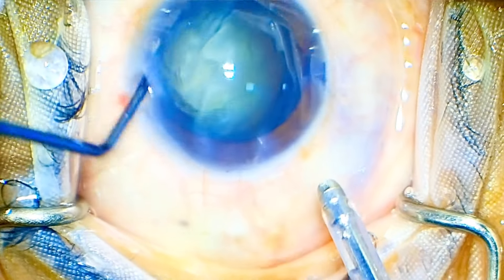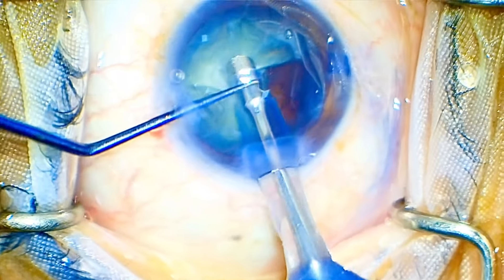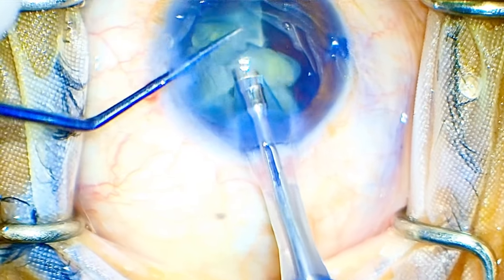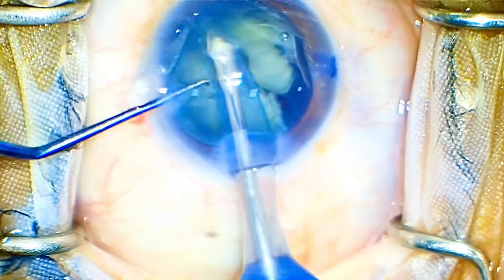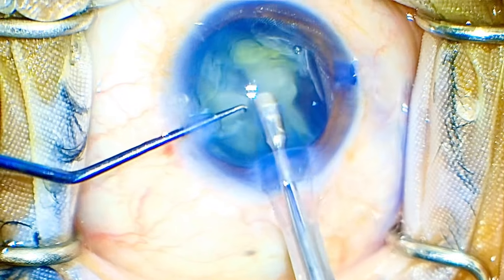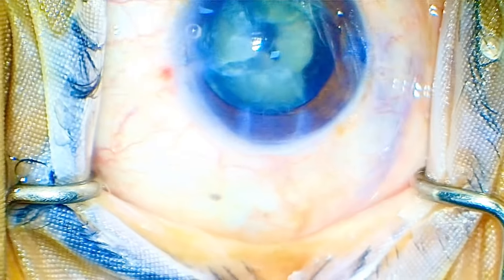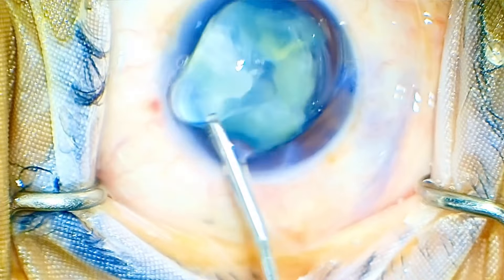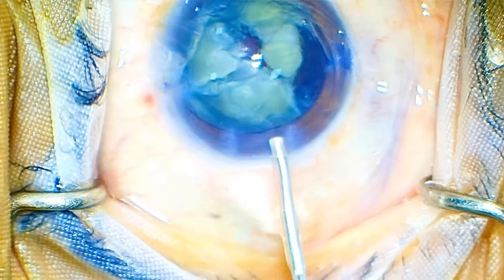I held my nerves and tried again — introducing the FACO tip into the anterior chamber, grabbing hold of one piece. It is pulling slightly, and I am able to make a chop once again. But as you can see, the tip is vibrating and irrigation is flowing — this is a typical, classic case of a pump failure. The flow is good, the FACO is working fine, I can hear the auditory feedback, but it is not pulling the pieces.